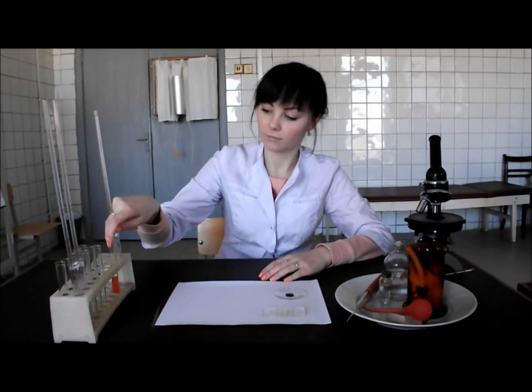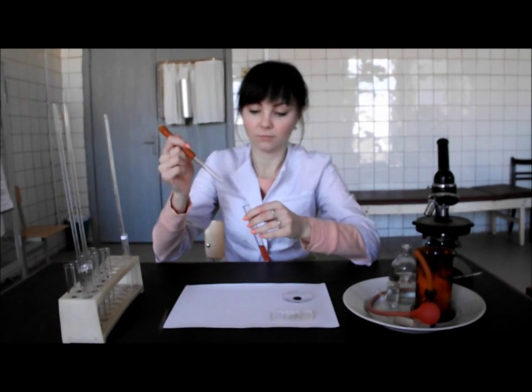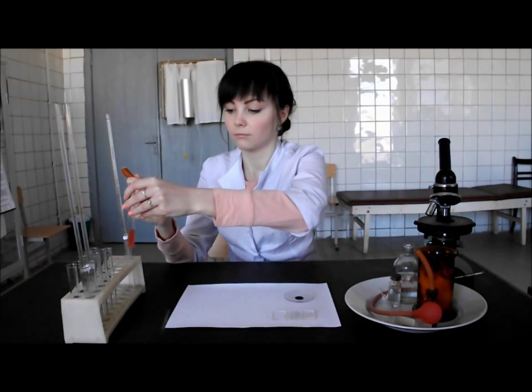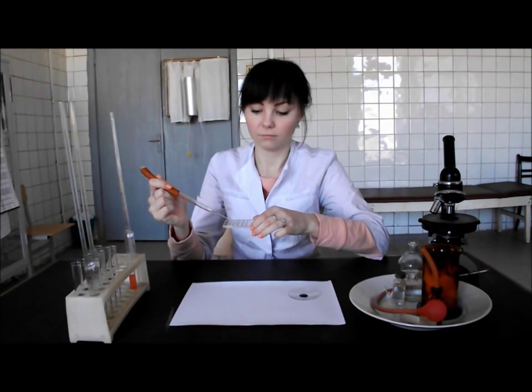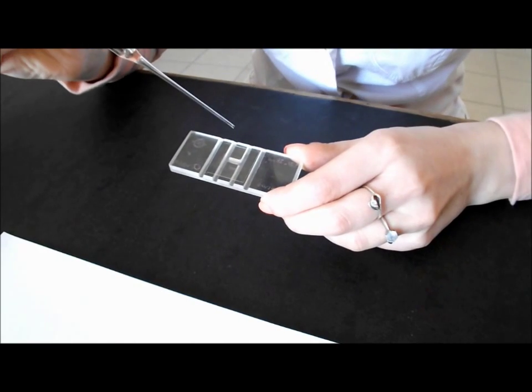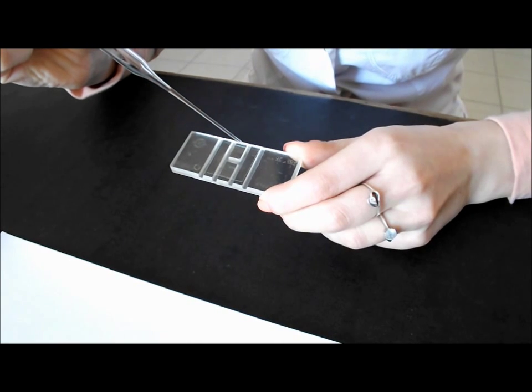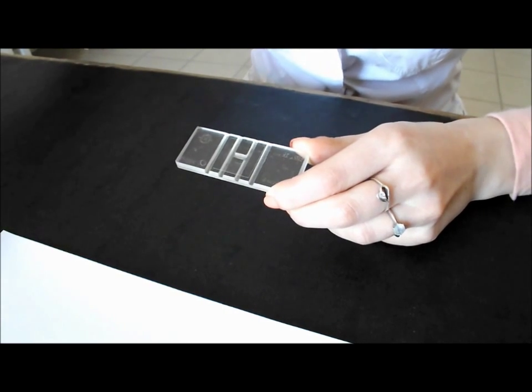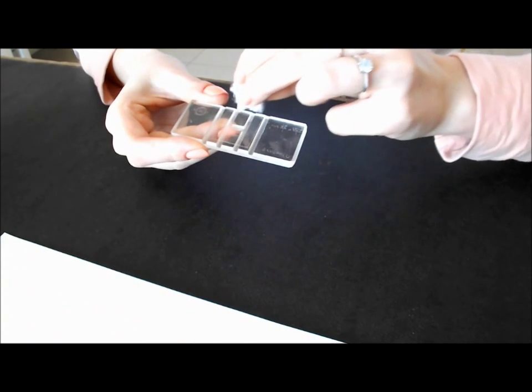Take the obtained solution into the Pasteur pipette. Bring the tip of the Pasteur pipette to the border of the cover glass on the chamber. Put a small drop of the solution on the middle stripe of the Goriaev chamber. It will run under the cover glass under the influence of capillary force. The excess of solution is removed with cotton wool.